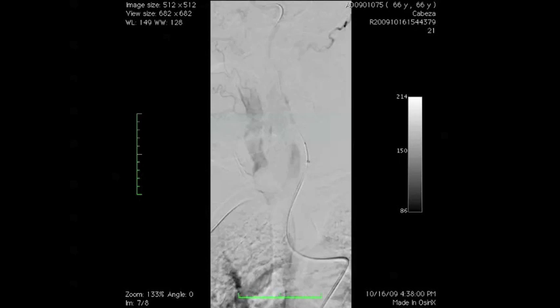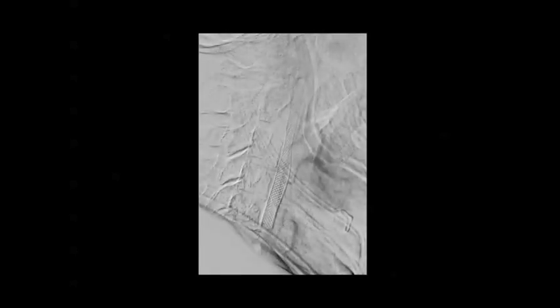We then progressed the guiding catheter into position, removed the 0.035 component, and used a Spider filter over that same 0.014 wire. You can see the Spider filter over the 0.014 wire, and this is the final image after stent placement.